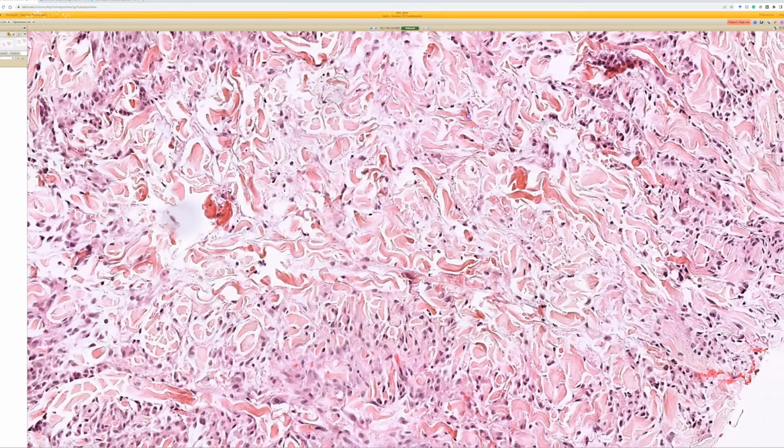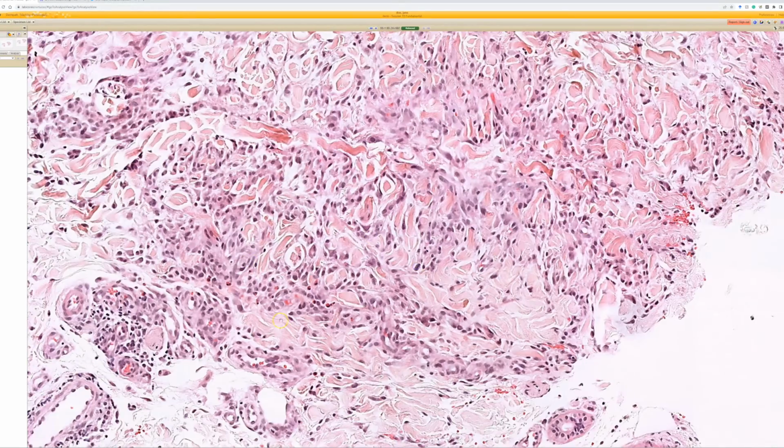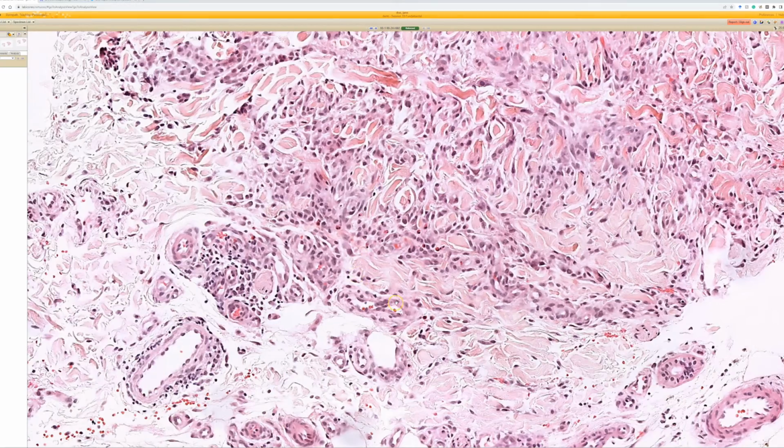So in any case, when you see that interstitial pattern alone, think about granuloma annulare for histiocytes trapping collagen. Even if you don't see the mucin, consider cutting deeper or trying a mucin stain. Look at the clinical to see if it could be GA clinically.